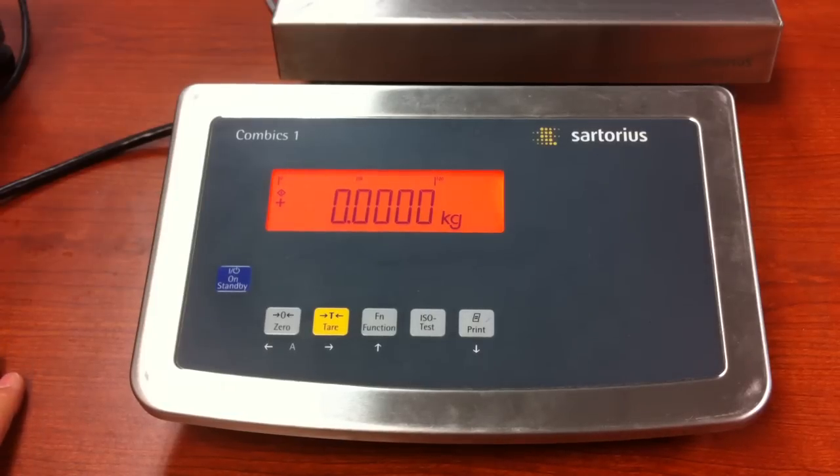Hello everybody. Today we are working with the CAIS COMVIX-1, also the CAISL COMVIX-1. This video deals with setting up the user-defined calibration weight. This unit is set up for 5,000 grams, and you will need to make sure that your calibration value is at least 20% of your maximum capacity.